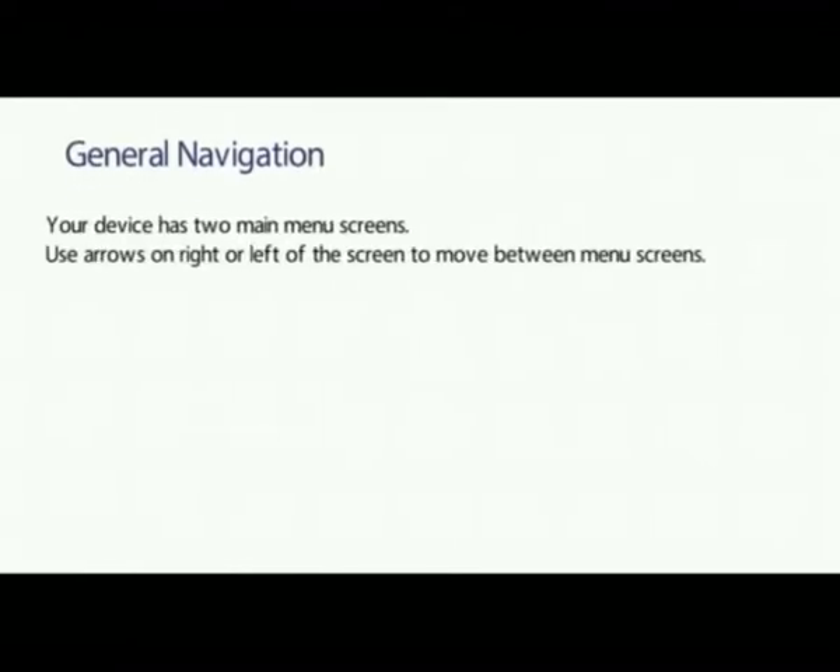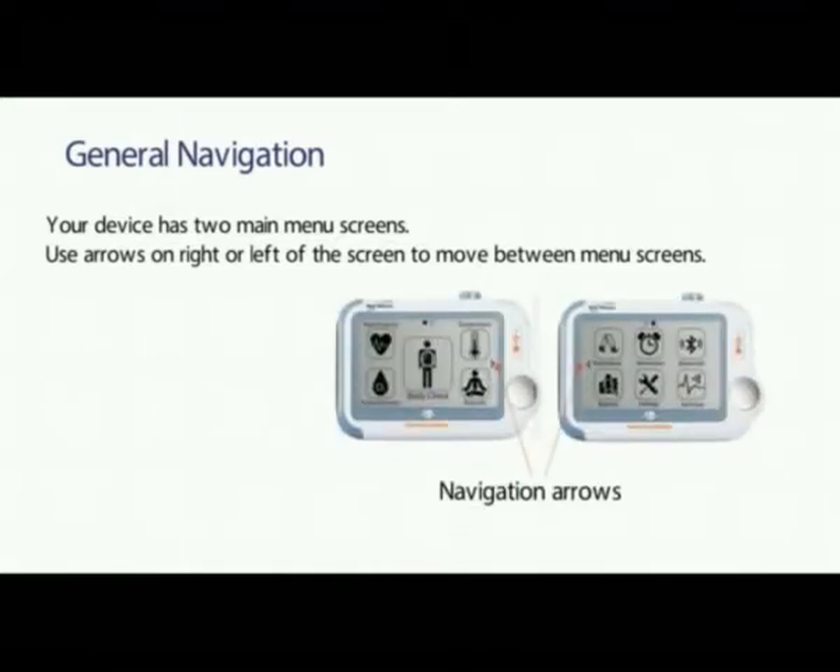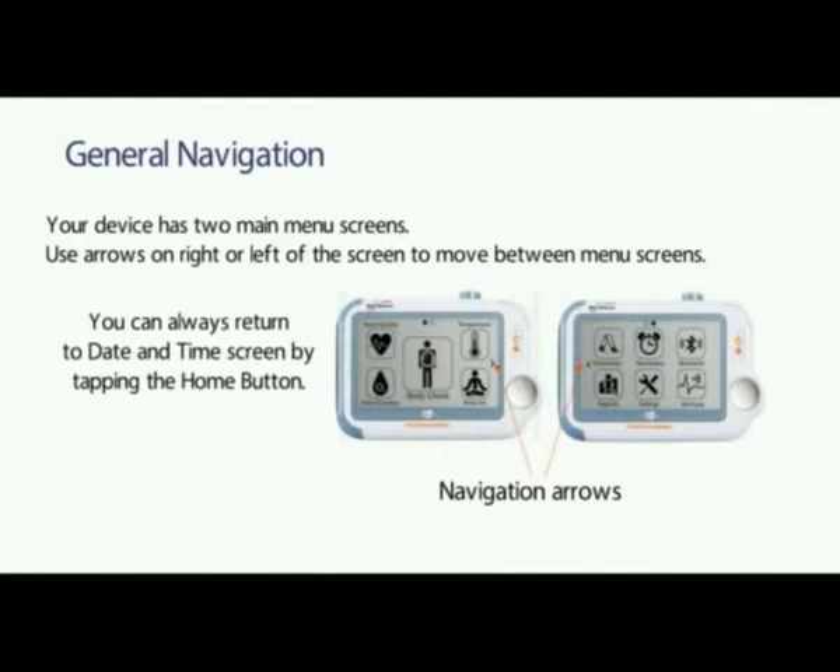General Navigation. Your device has two main menu screens. Use the arrows on the right or left of the screen to move between the menu screens. You can always return to the date and time screen by tapping the home button.